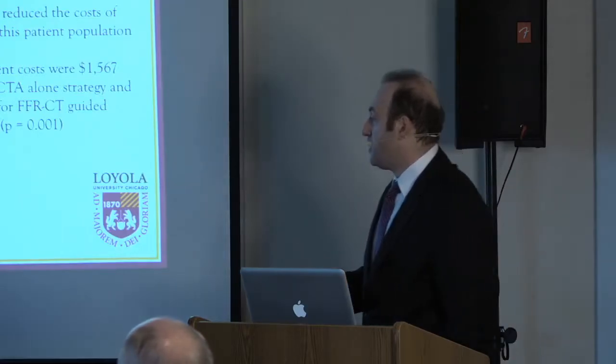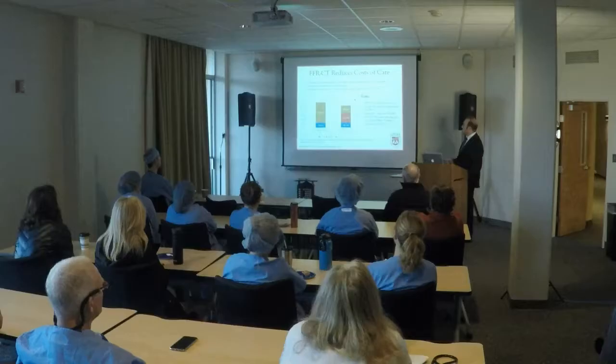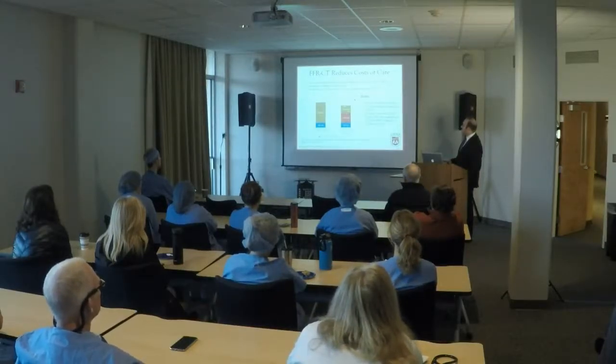This is some data that I presented at the American College of Cardiology in 2017, looking at cost analysis. Now over 200 patients with a suspected CAD and CT plus FFRCT if needed. And again, no adverse events were reported in any of the patients whose caths were canceled. And with the CT alone guided strategy, you can see the high cost of invasive coronary angiography here, roughly $258,000. Now, after incorporating FFRCT, that invasive coronary angiogram cost goes down significantly to around $96,000.